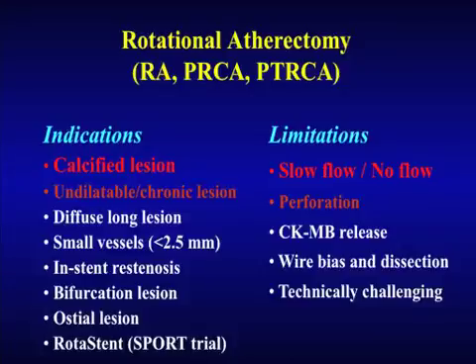Now this case by definition will become a calcific lesion because of the extensive calcium which you see irrespective of the cardiac cycle. The issue with rotational atherectomy, as we very well know, is that this is a device which at one point had very good wide acceptance, but then it fell down largely because of the limitations or complications. The two most common being slow flow and no flow, and perforation.